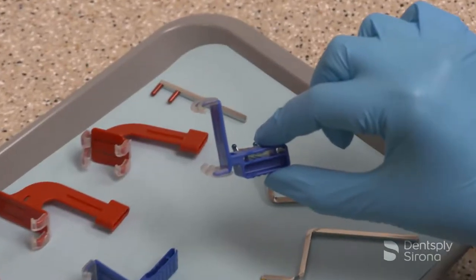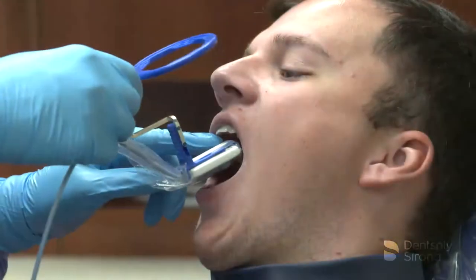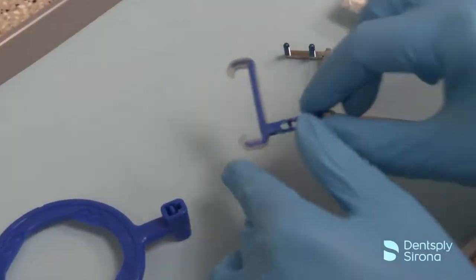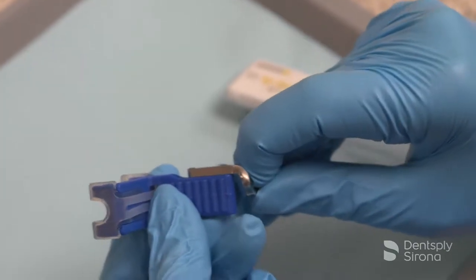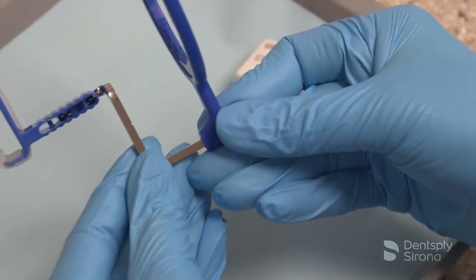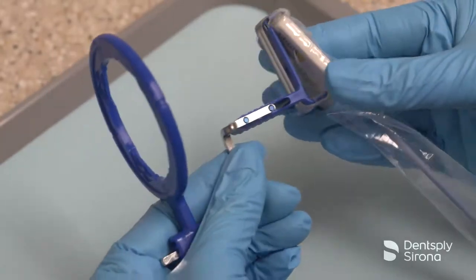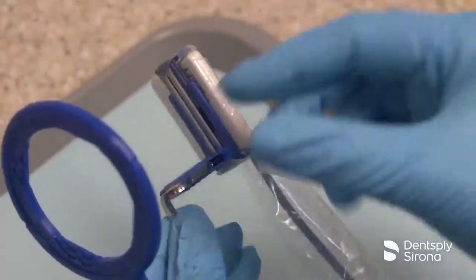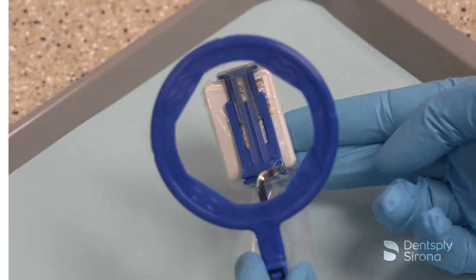There are two options for anterior bite blocks: a thicker bite block and a thin bite block, which makes it easier to place in the patient's mouth when using a size 2 sensor. To assemble the XCP short arm with the XCP DS-FIT anterior bite block, place the blue pins on the arm into the side of the blue bite block and slide the arm into the blue aiming ring. After placing the sensor into a RIN digital sensor cover, securely insert the sensor into the blue bite block, making sure that the active side of the sensor is against the flat surface of the bite block.